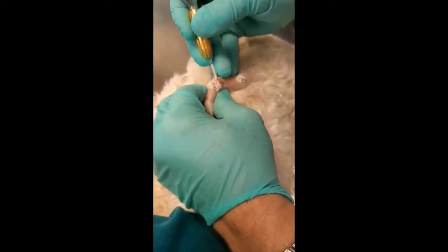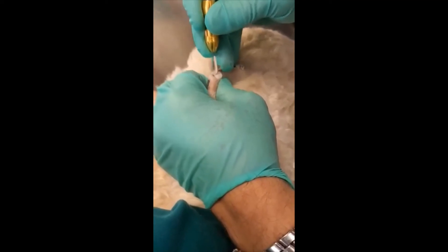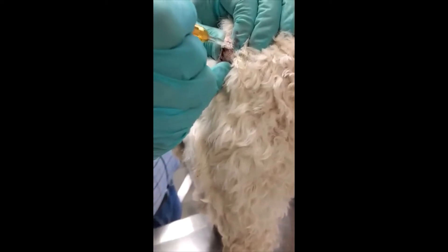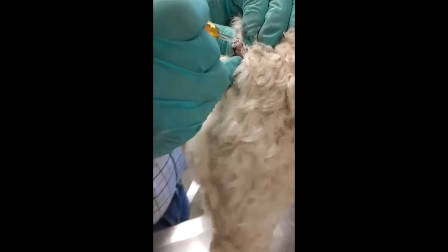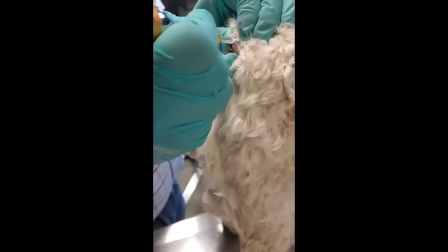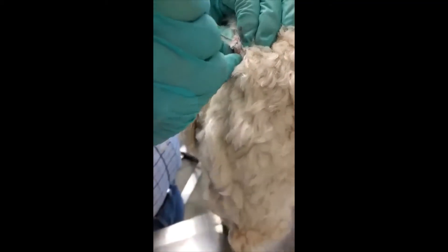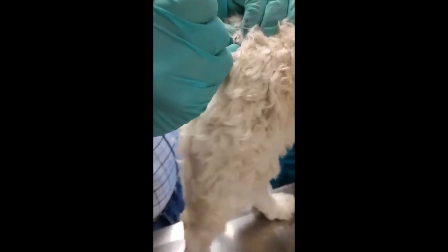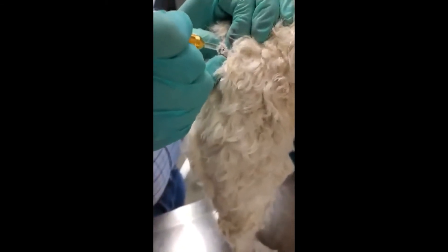Five more seconds. 30 seconds. Some of these are more tissue dense, and so we are extending the freeze cycle for 45 seconds. There are additionally some papillomatous masses on the distal limbs where surgical removal would be very difficult due to the lack of sufficient tissue for closure.